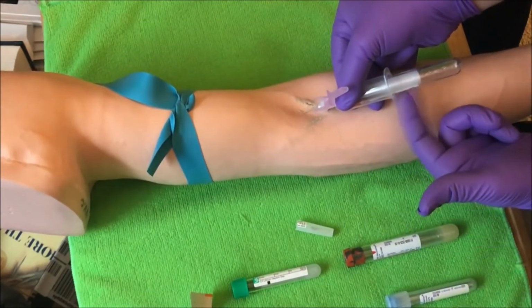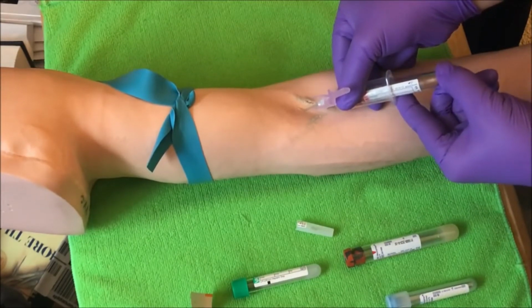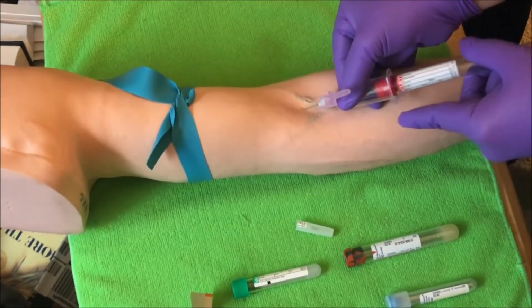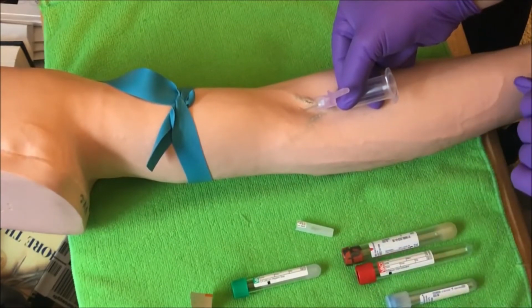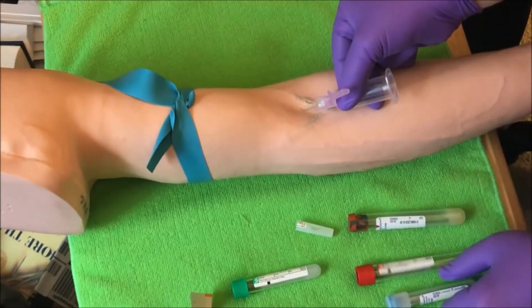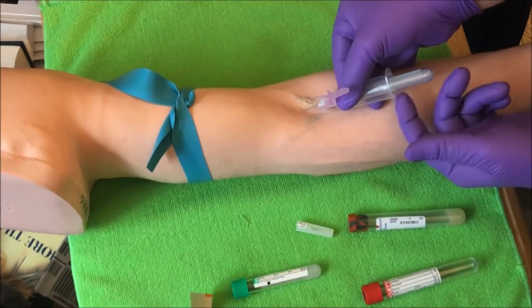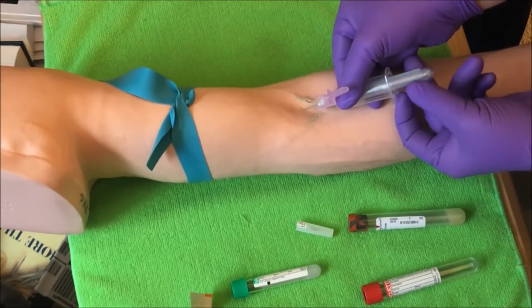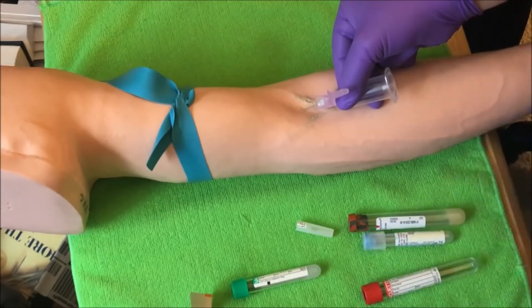My index finger rests right here, middle and thumb twist and push away once it's full and it's stopped, and this will help release it. Invert, bring it down. SST tube next, then my green and lavender. So again, label down, pop, let it flow, index finger right here, middle and thumb grip the tube, twist and push away, invert, set down.